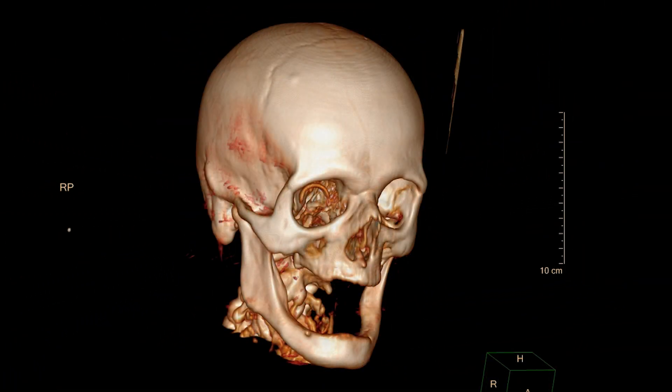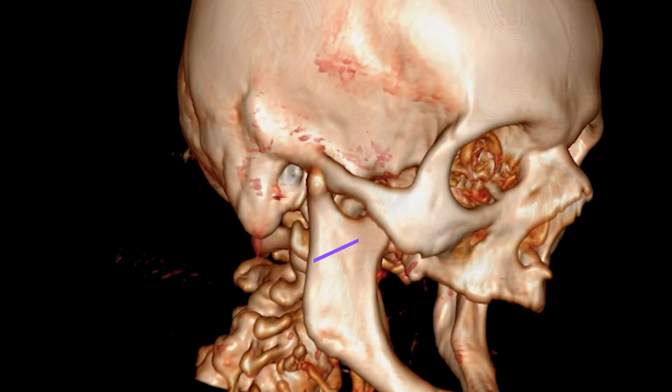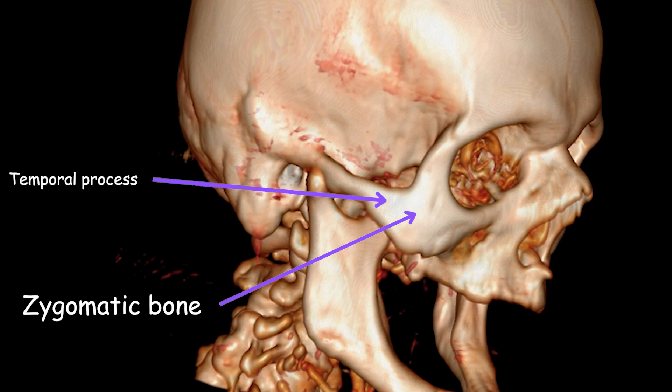The zygomatic bones are located at both sides of the face and consist of two parts. The temporal process of the zygomatic bone is a thicker and more robust projection that extends backward from the zygomatic bone, forming the anterior and inferior part of the zygomatic arch. The frontal process of the zygomatic bone, part of the cheekbone, extends superiorly and medially from the zygomatic bone, forming a bony projection towards the frontal bone.